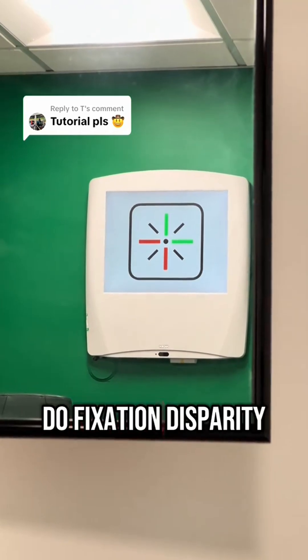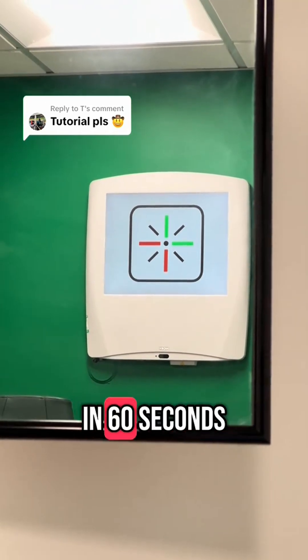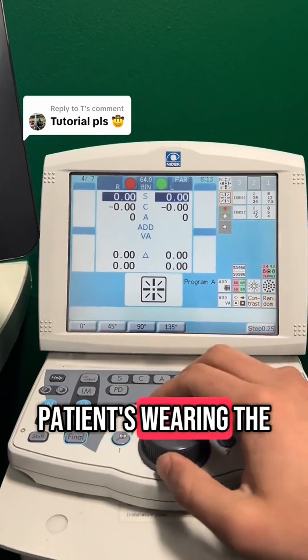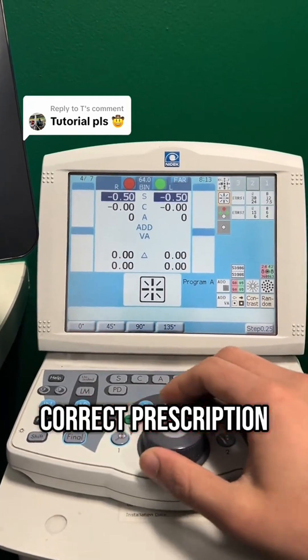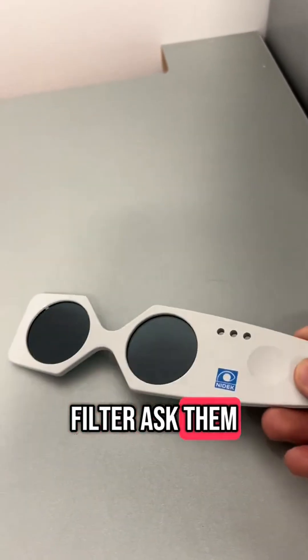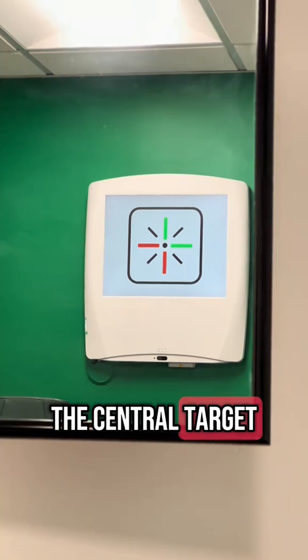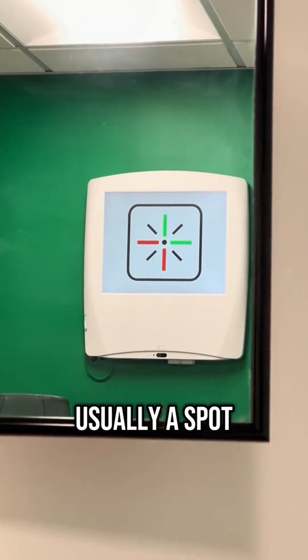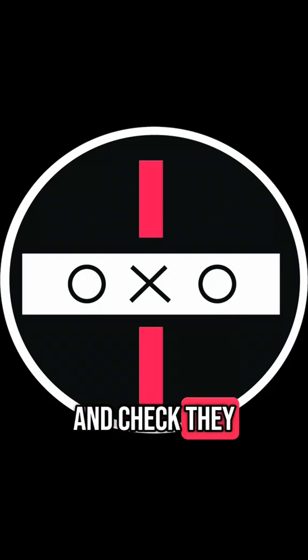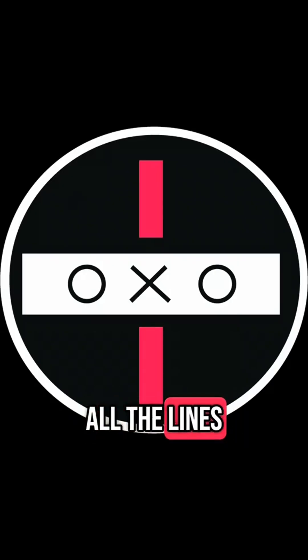Here's how you do fixation disparity in 60 seconds. Make sure the patient's wearing the correct prescription and the polarised filter. Ask them to focus on the central target, usually a spot or an X, and check they can still see all the lines.